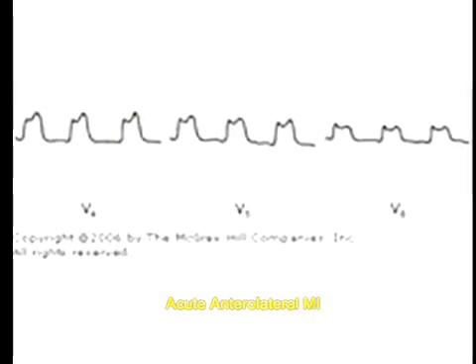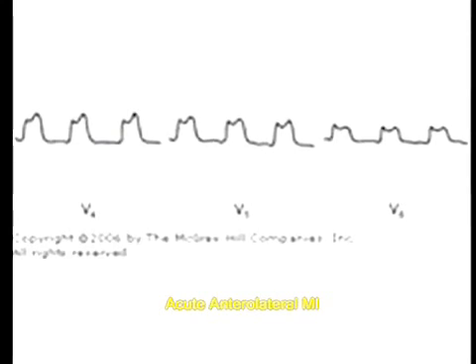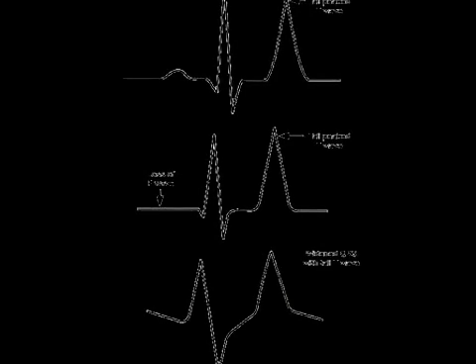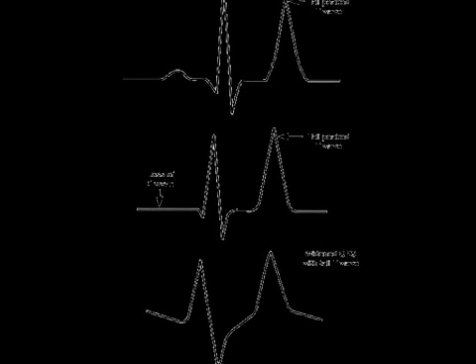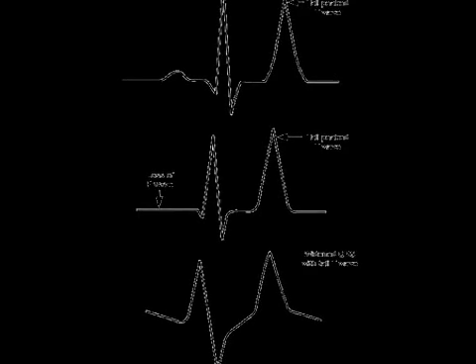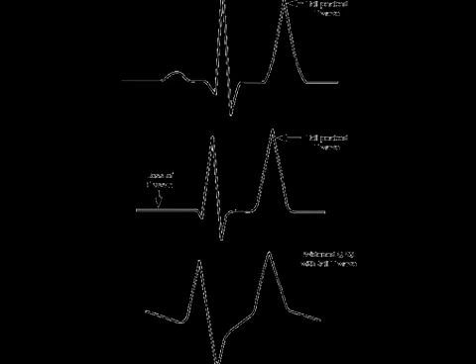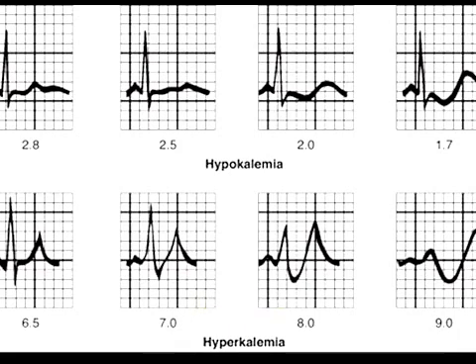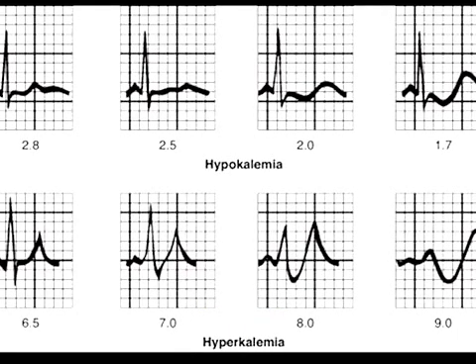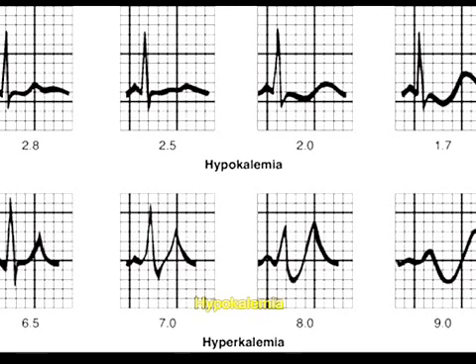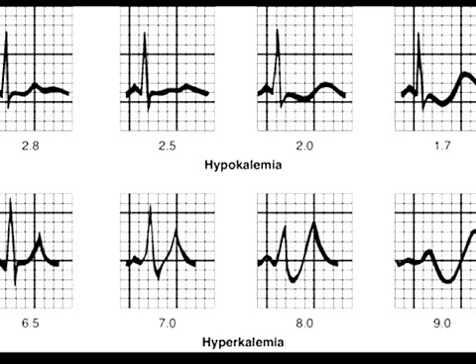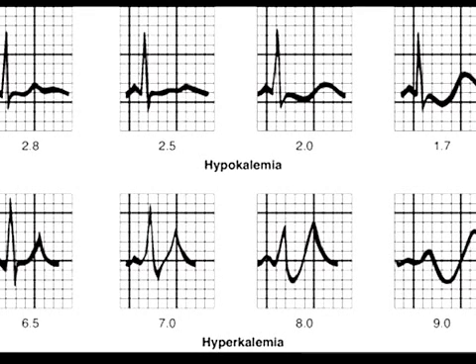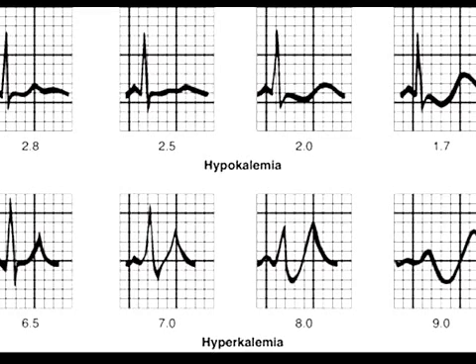Now let us see abnormalities in electrolyte disturbances. First, hyperkalemia. In hyperkalemia you will see big tent-shaped T waves. You can see here the T wave is as big as the QRS complex — this is very characteristic of hyperkalemia, that is high potassium level in the blood. In hypokalemia, that is low potassium level, you can see U waves following the T wave.